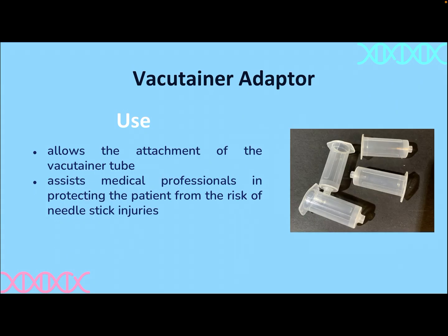Next is a vacutainer adapter. It allows the attachment of the vacutainer tube. It also assists medical professionals in protecting the patient from the risk of needle stick injuries.